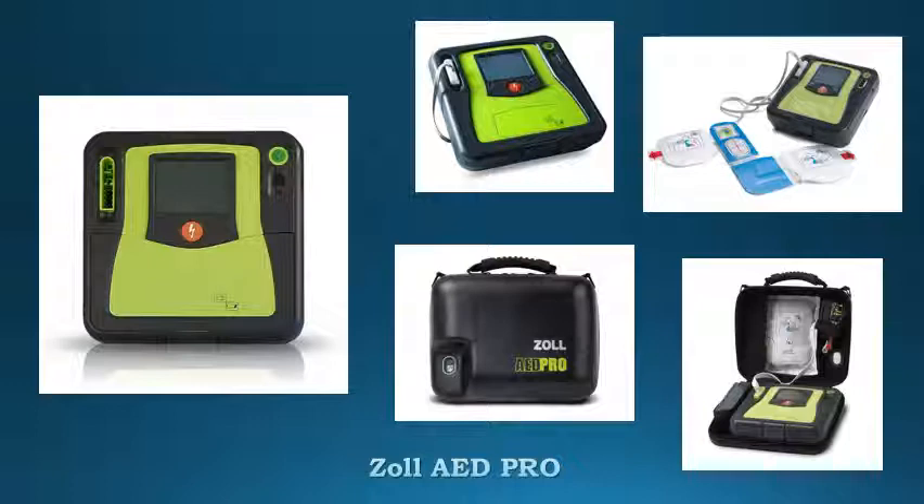ECG monitoring with 3 LED cable and high-quality display. Unrivaled battery options that meet your specific needs. Easy unit configuration through result administration software. Intelligent pediatric capability.